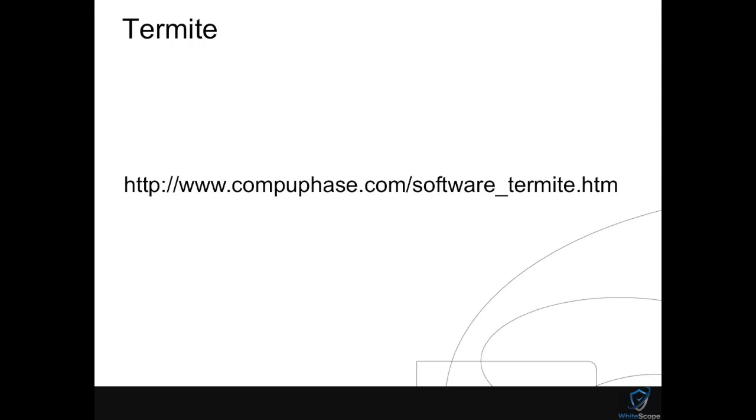There are some ways to tap into the serial communications, which is interesting. You can actually man in the middle serial communications pretty easily. I use some software called Termite. I highly recommend it if you're trying to inspect any kind of serial data traveling over the wire. And I'll talk a little bit about deployment, then I gotta end here.